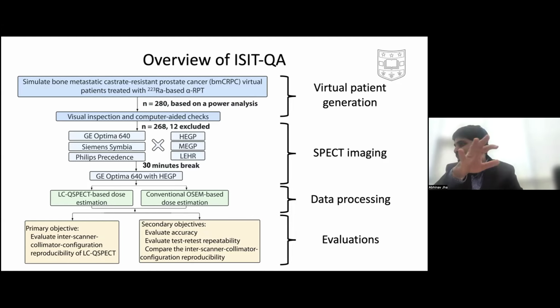This is a prospective study. You just start with what you do, and then you let the science take over, right? And then you don't go back, right? So the data is what it tells you, and then you eagerly wait for the data, biting your nails and seeing whether everything works out. And thankfully, in this case, it did, right? So you predefine your exclusion criteria, which would be like, do you recall on this one what it was?